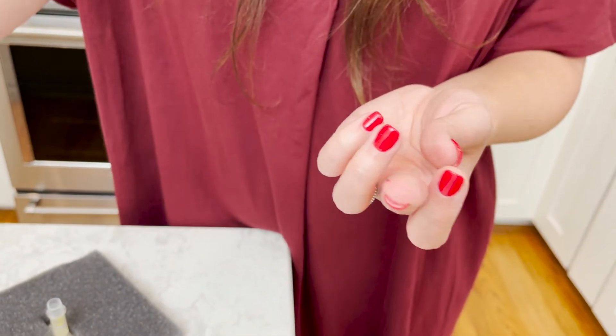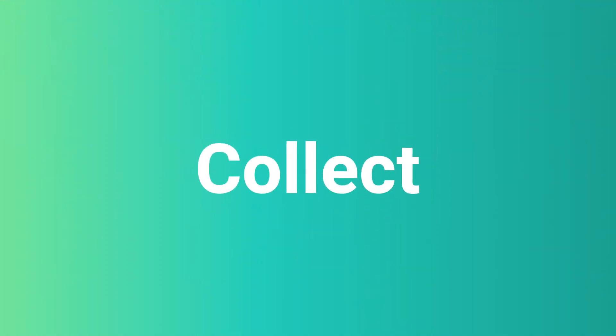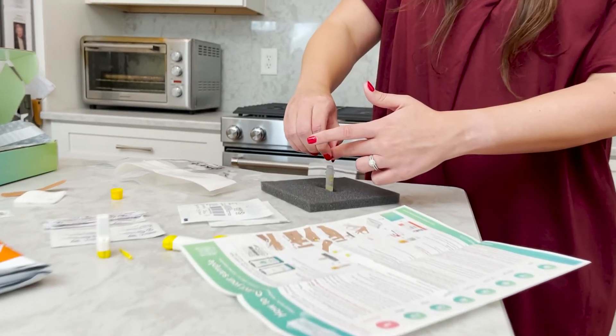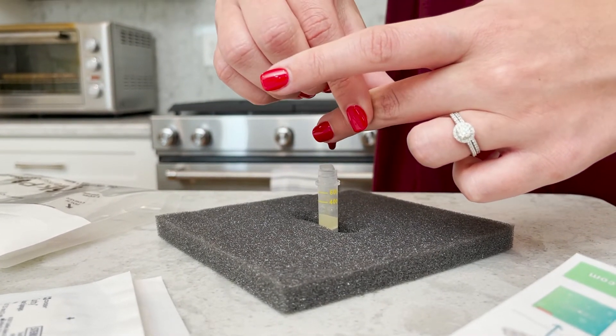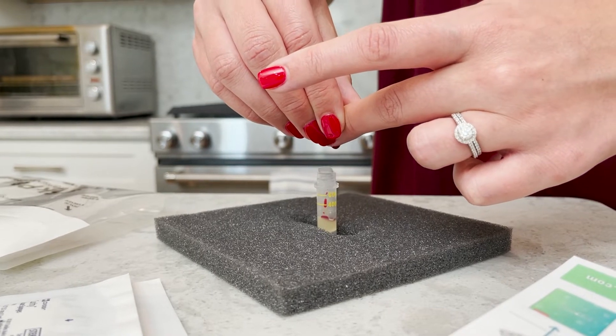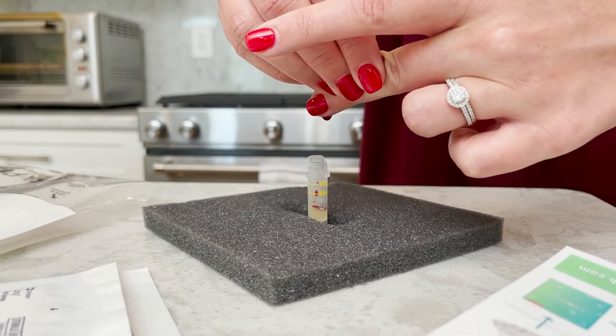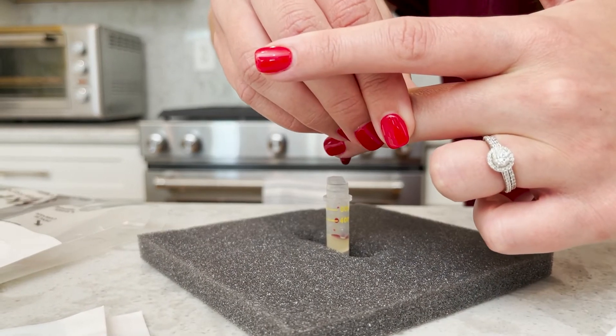Wipe away the first drop of blood on a clean piece of gauze. Step 5: Collect. Place your finger over the microtainer tube as the drop of blood begins to form. In a milking motion, squeeze your finger from the base of the fingertip to form a large blood drop and fill the microtainer tube between the 400 and 600 markings on the tube.